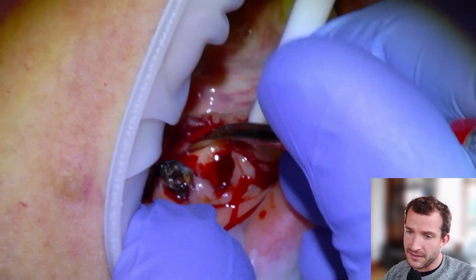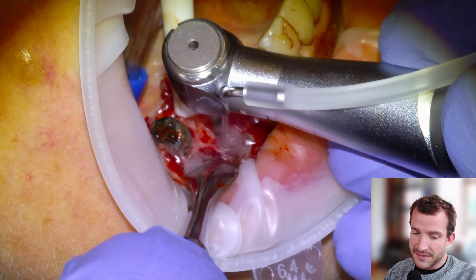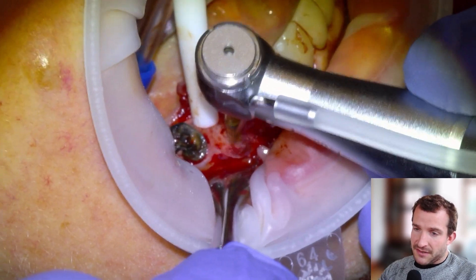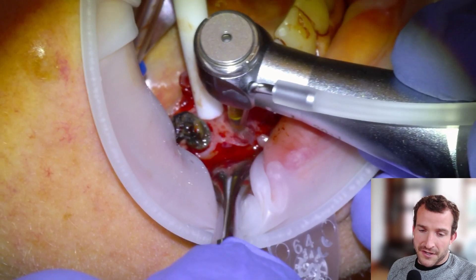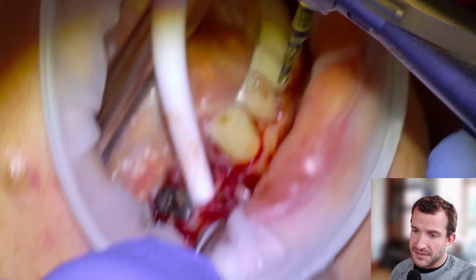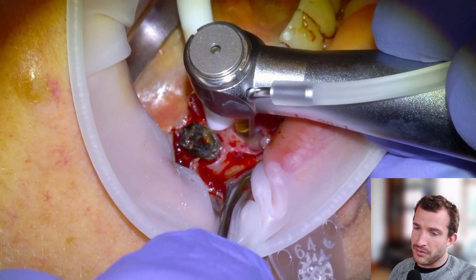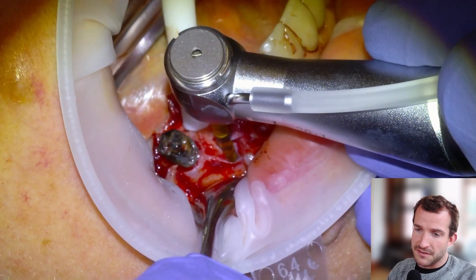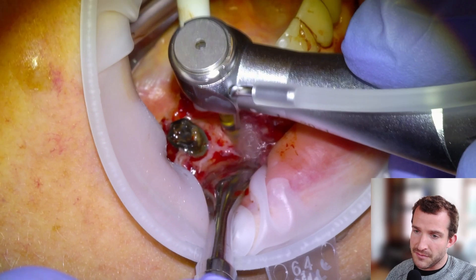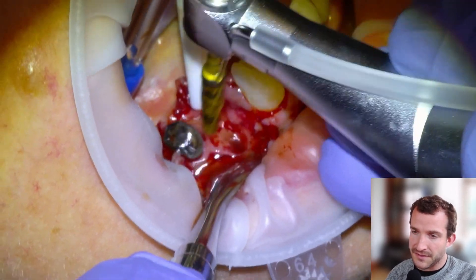So here we are just reflecting so we have good clear access. Big thick lingual plate — we're always going to place our immediate implants closer to the lingual aspect of the socket, because the buccal side is usually the one that's thinner and where threads could be exposed. So we're basically just going to take our Lindemann and punch through the apical cortex of bone, and then go in with our osteodensic or VersaBurs on clockwise motion, and take them down about 12 millimeters or so.